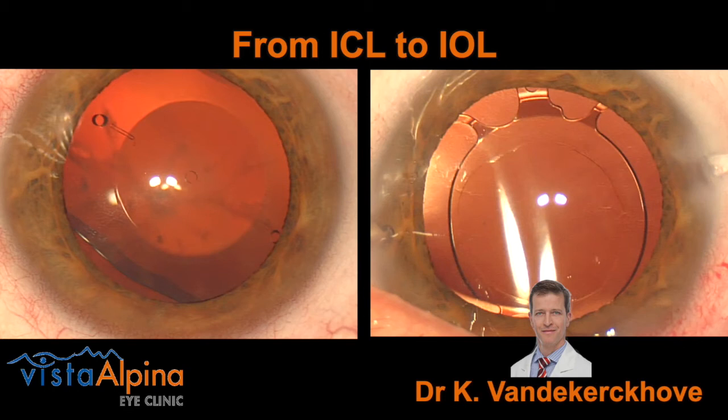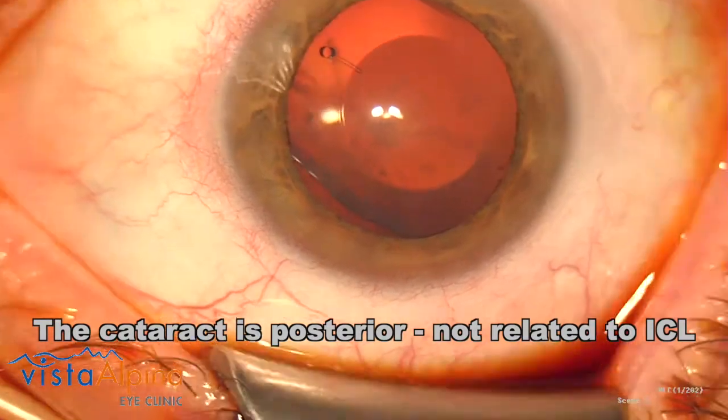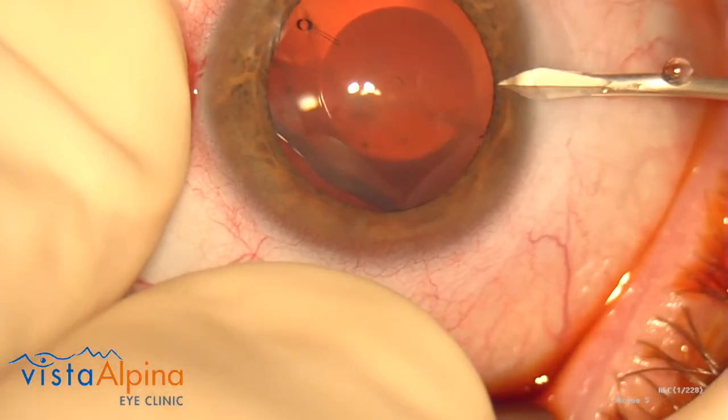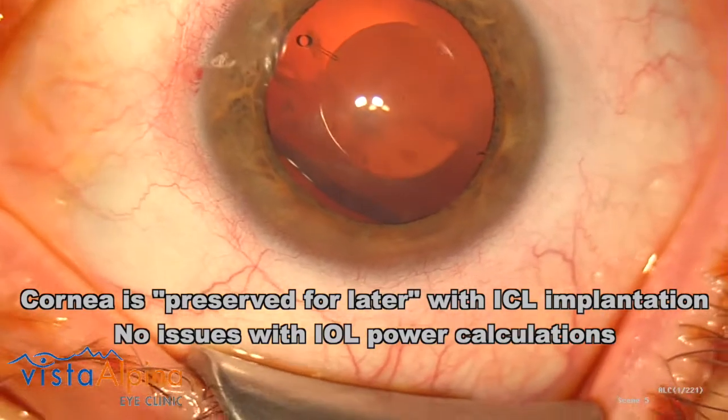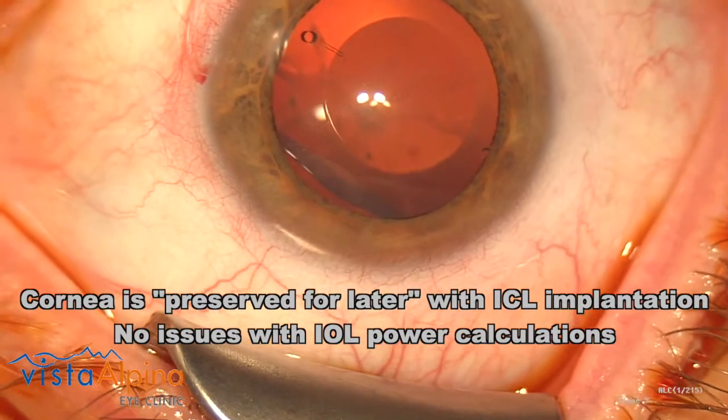ICL-related cataracts are extremely rare with the newer versions of the ICL. Whether they had LASIK or an ICL before, patients will again ask for refractive solutions at the time of cataract surgery. Thanks to an unaltered cornea, we can fully rely on biometry and topography data in this ICL case.